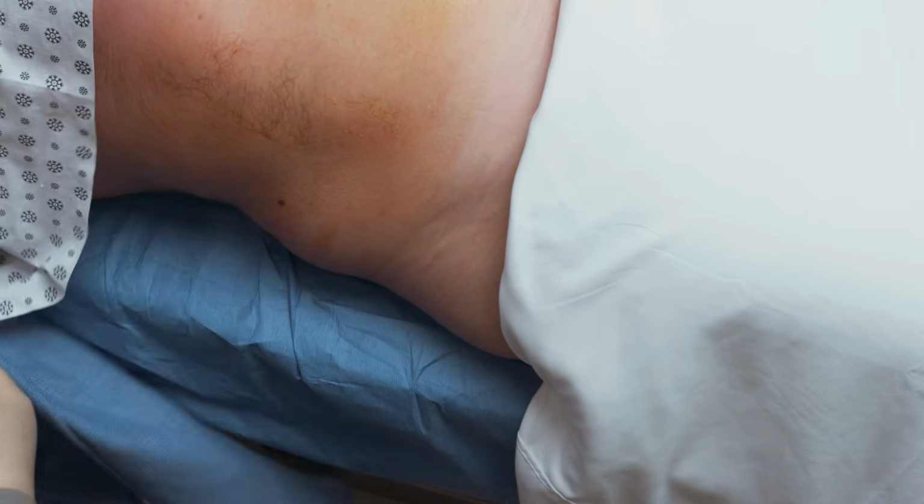When you're finished prepping, discard any portion of the solution not required to cover the prep area. It is not necessary to use the entire amount. Always discard the applicator after a single use.